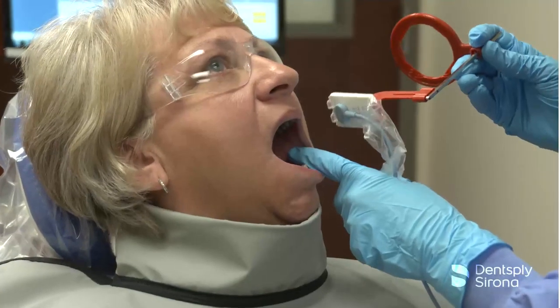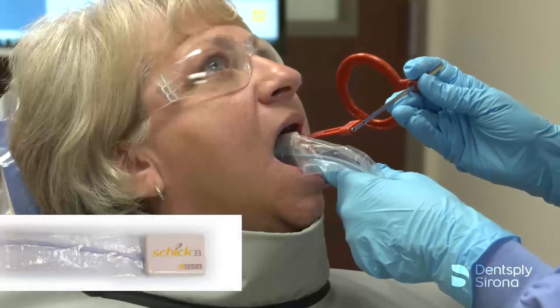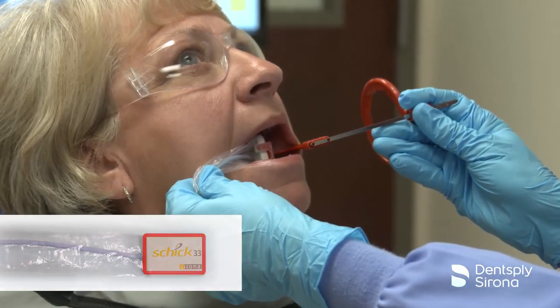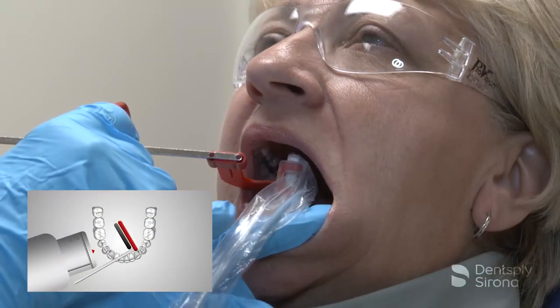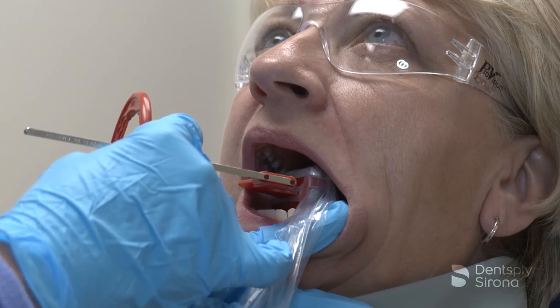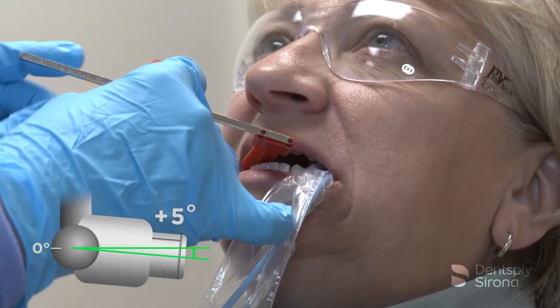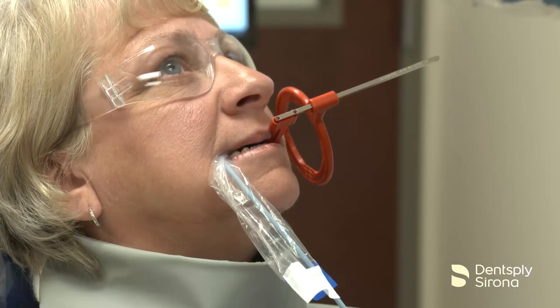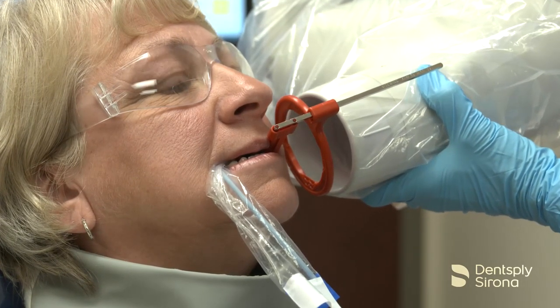The clinician aligns the interproximal indicator slot with the interproximal spaces to ensure open contacts. Due to the inactive portion of the sensor or limited access, a cross-arch placement of the sensor may be necessary, along with an adjustment to the horizontal angulation of approximately 15 degrees distal to mesial, to achieve a quality diagnostic radiograph. The vertical angulation is typically set at positive 5 degrees. Once the bite block is in place, slide the aiming ring down the arm close to the patient's face, align the tube head, and the X-ray image is ready to be captured.